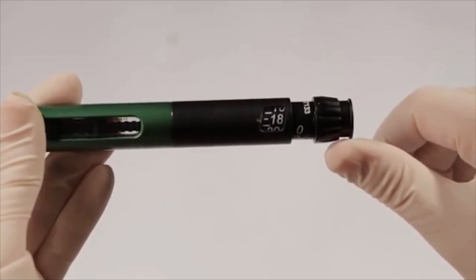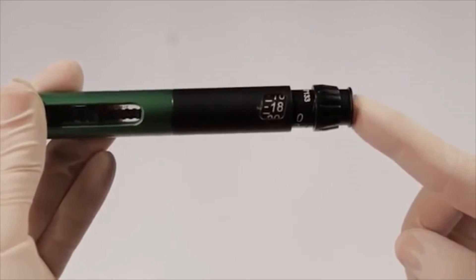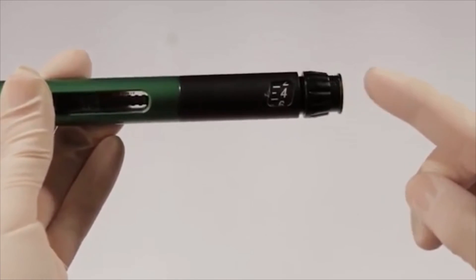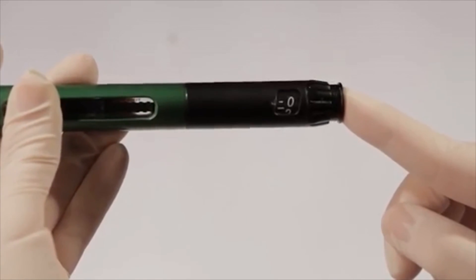If the button will not depress smoothly or seems stuck, check to make sure the rotating dial is not caught in your thumb or glove when pushing in. You may also try tapping with your thumb or finger on the top of the button to move it along. Never force the button in — this may damage the pen mechanisms.